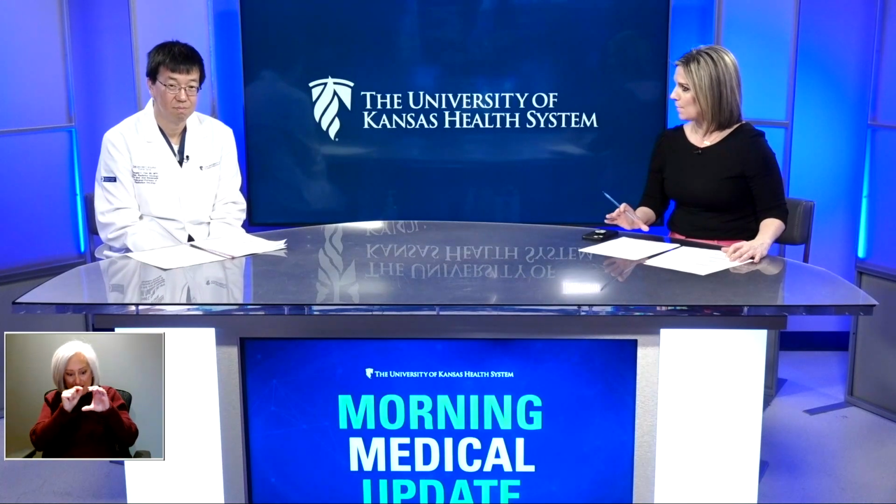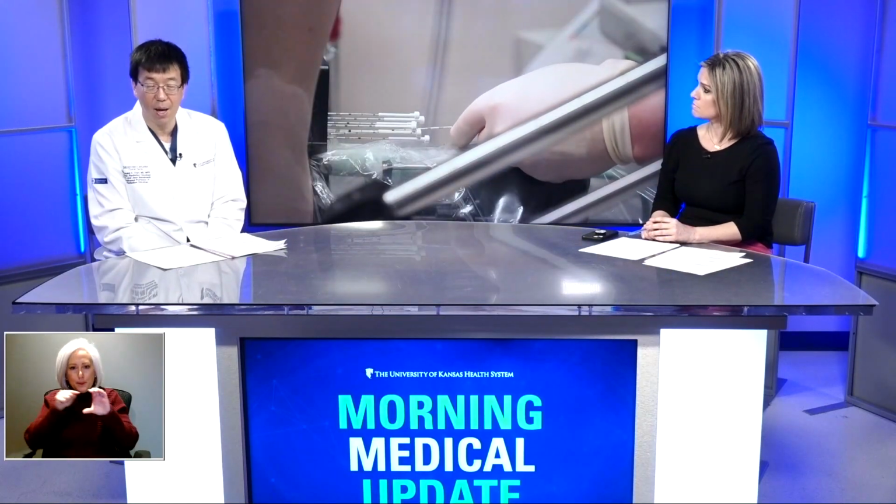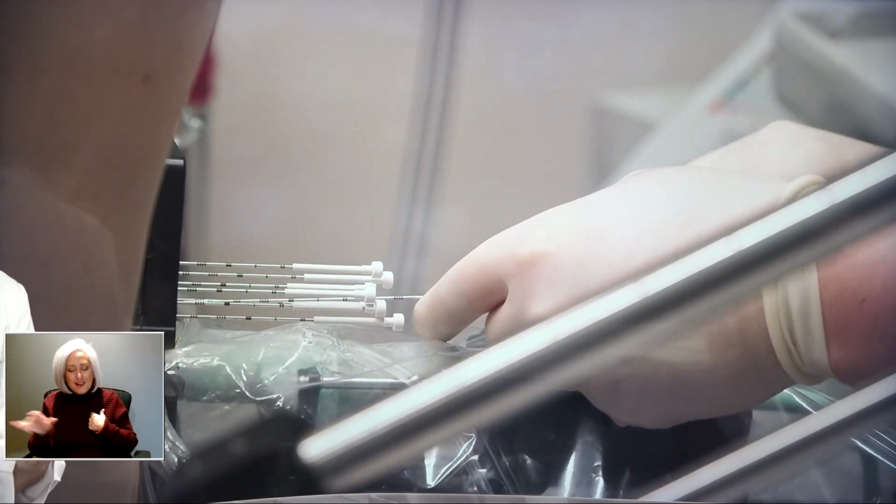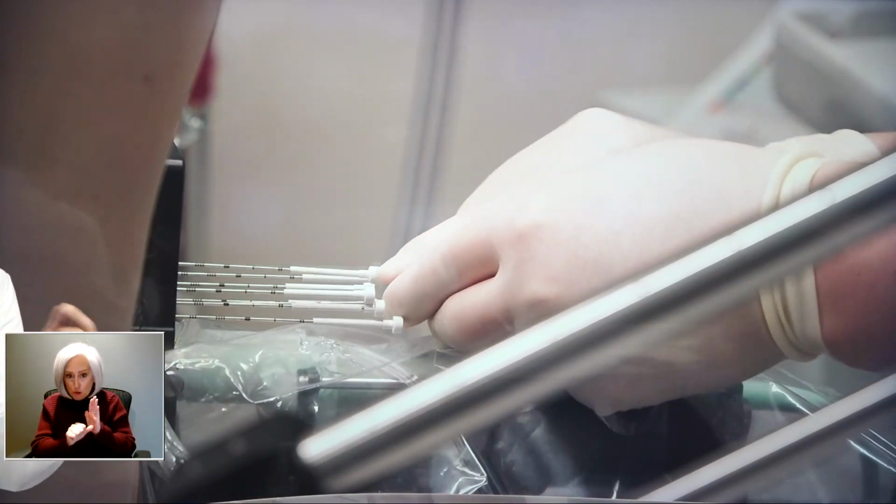This is not open surgery, so what is it like in that moment? Instead of cutting them open, you're putting them right in there. Well, what I tell patients is that brachytherapy for prostate cancer is very similar to a prostate biopsy. Every patient has gone through a biopsy to diagnose the cancer, and brachytherapy is kind of a similar procedure. It is not surgery at all. There's no cutting. I don't sew the patient.